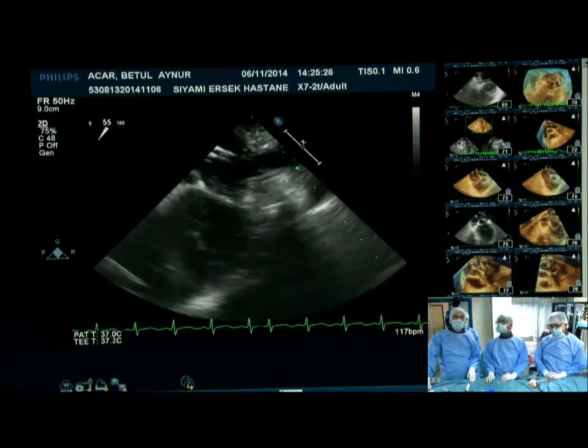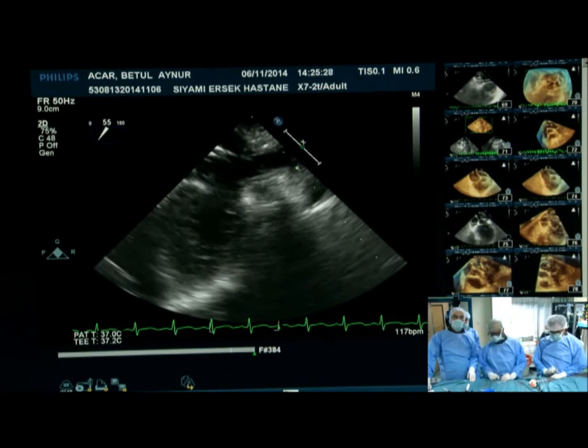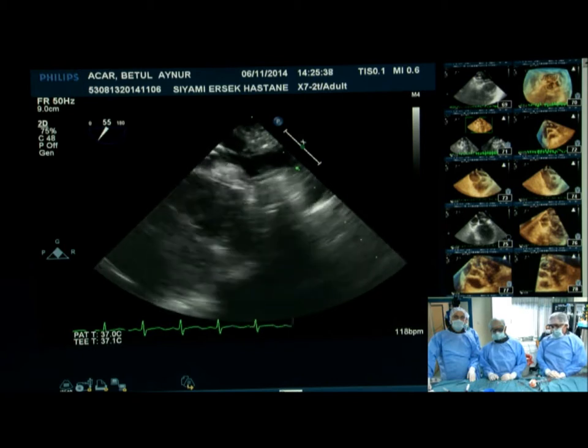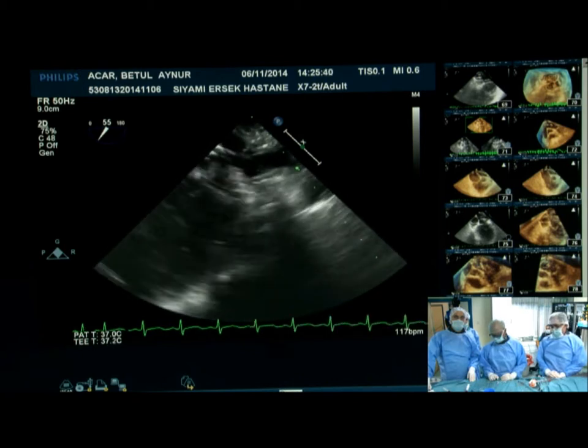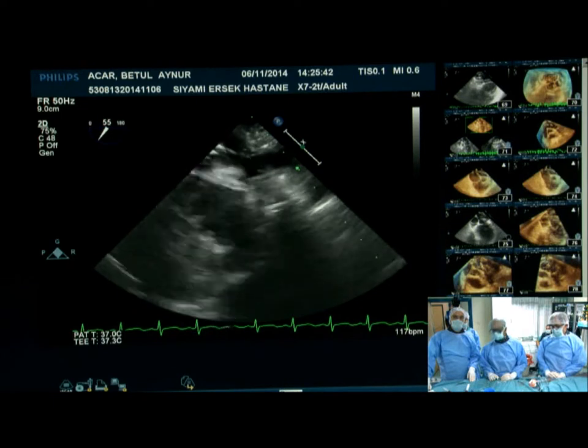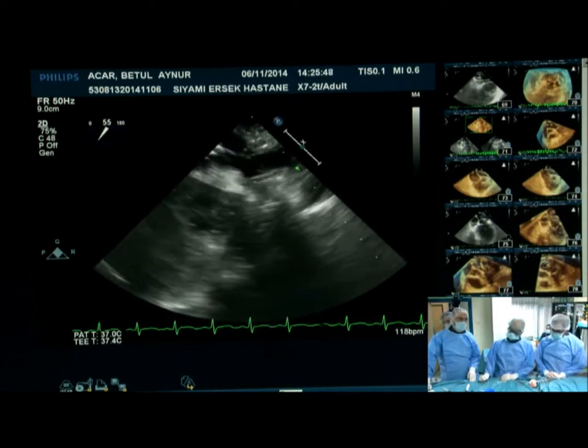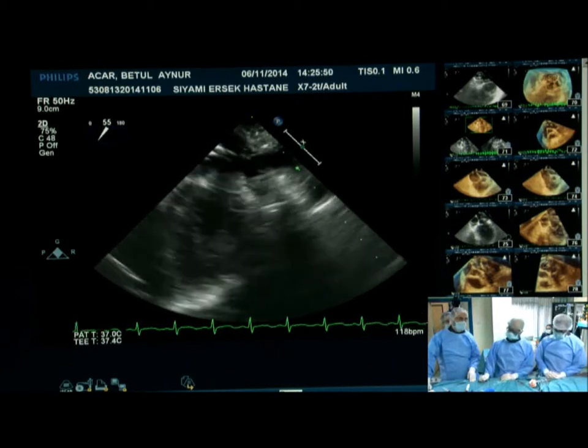Cribriform. Now, we thought about or discussed that. Now, why would you use, what size cribriform would you use? I also second the cribriform in the smaller defect. A 30 millimeter cribriform device. Which size? 30 millimeter. Now, Dr. Carminati has a comment.